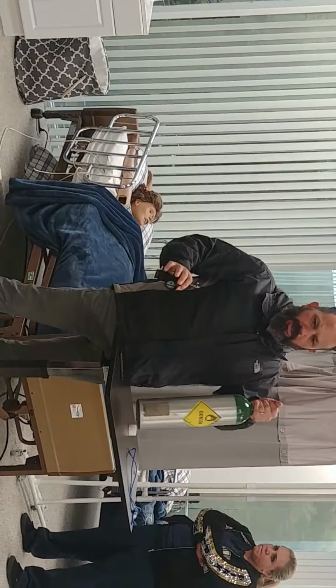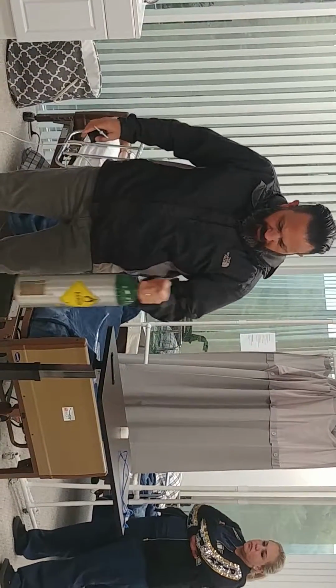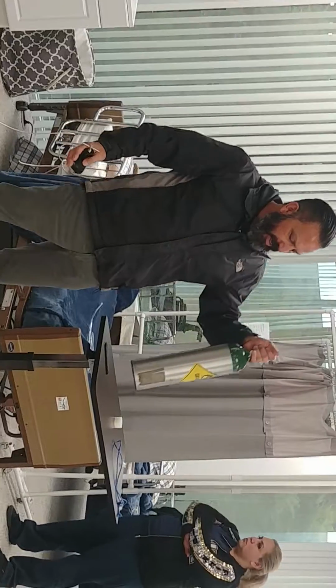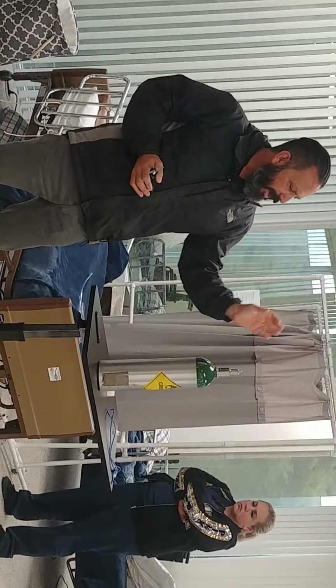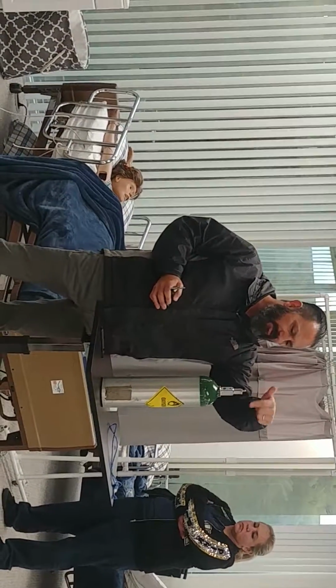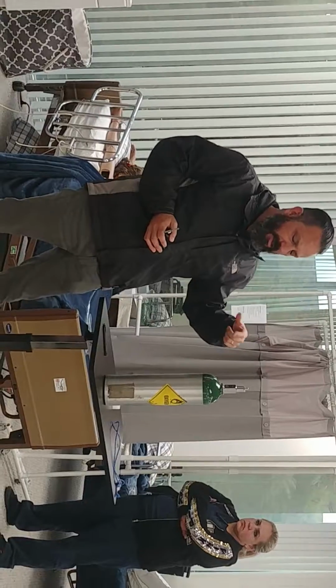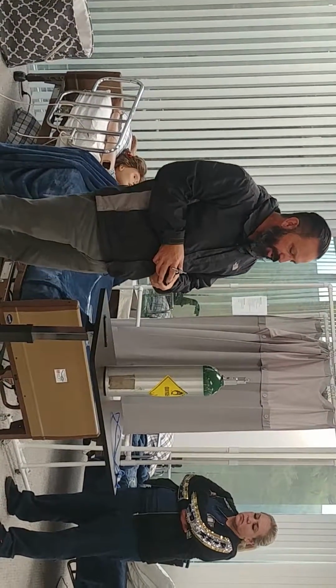If you're in your ambulance, you have these carriers for these cylinders where you just put it in the chute and you secure it with the chain. They cannot just be thrown around. So now we have that bottle that we just exchanged for. We took off the plastic security wrapping around the top, and now we inspected it and we're good to go.